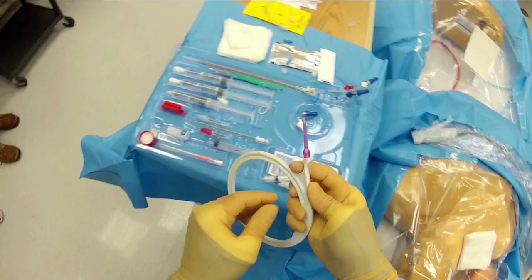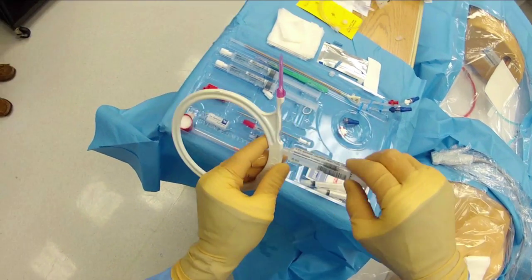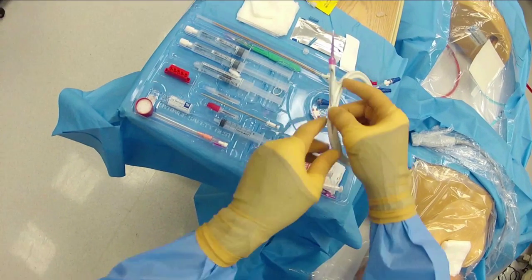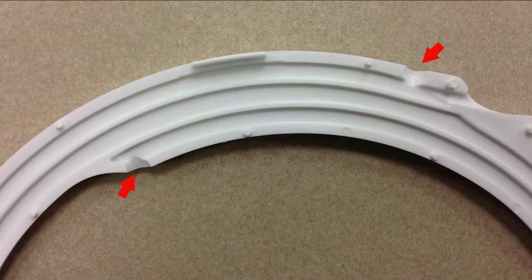Next we prepare the wire. We slide it in and out to make sure it threads well. There is a port on the top that we inject a little saline through — this is more of a sterile technique step, but it gets the air out and lubricates the wire. The holder has an entry port and an exit port that you can flush with saline if you want.